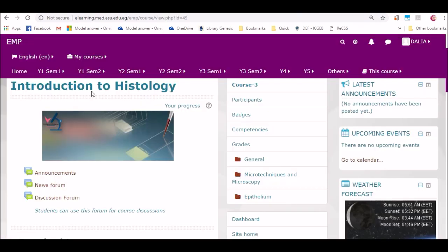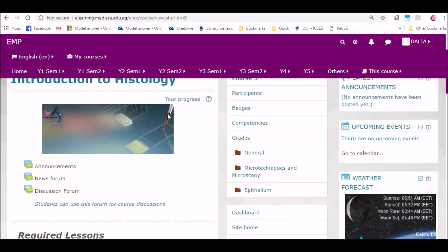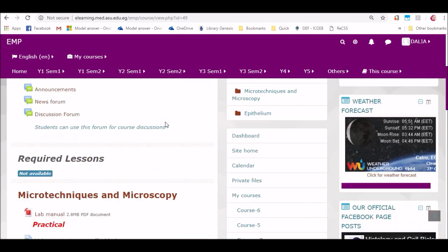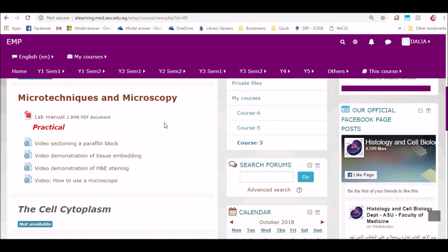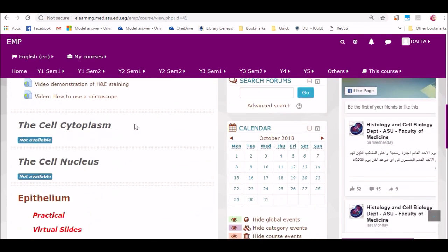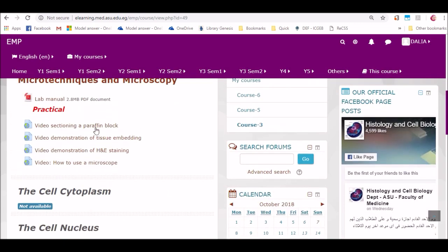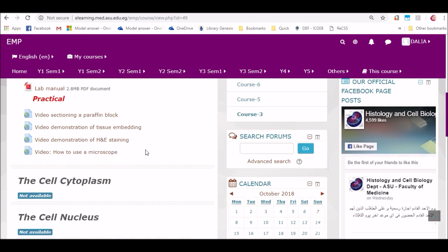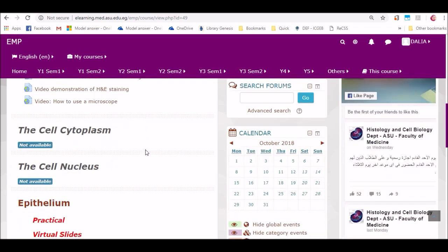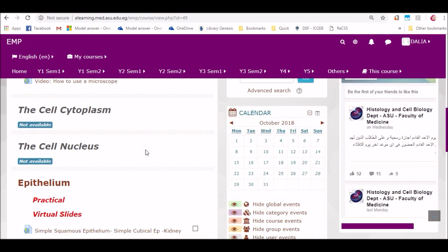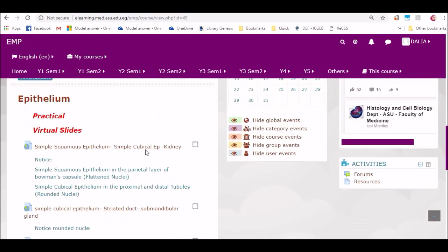Now we will shift on Moodle. If you don't have a Moodle account or you can't access it, please seek assistance from the IT unit in your faculty. In Moodle, you will find all your given courses and materials. In this example, this is the introduction to histology. You will find the different topics that you study. In this example, this is the epithelium. In Moodle, you will find different subtitles.